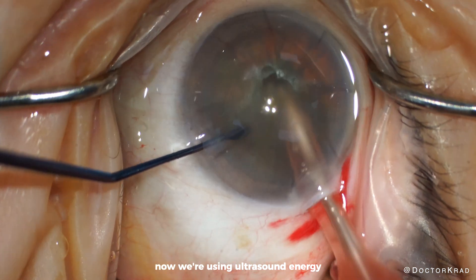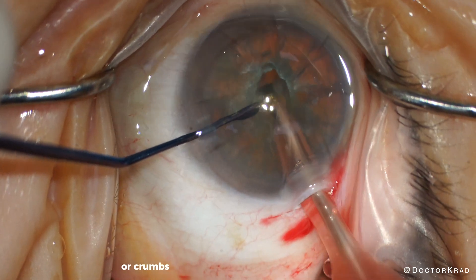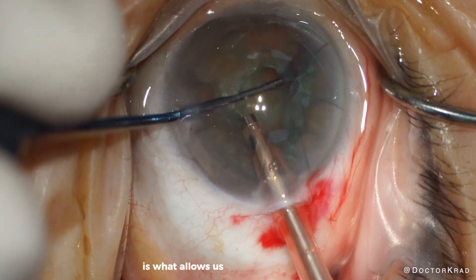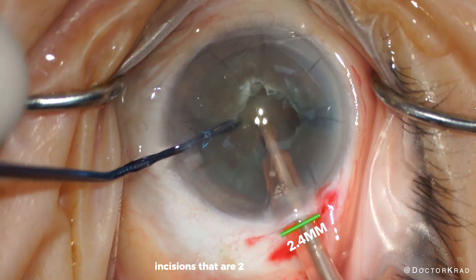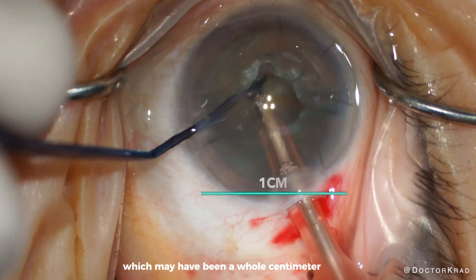Now we're using ultrasound energy to break the cataract into fragments or crumbs. Breaking the cataract into little pieces is what allows us to remove the cataract through tiny incisions — incisions that are 2 to 3 millimeters instead of the old way, which may have been a whole centimeter in size.